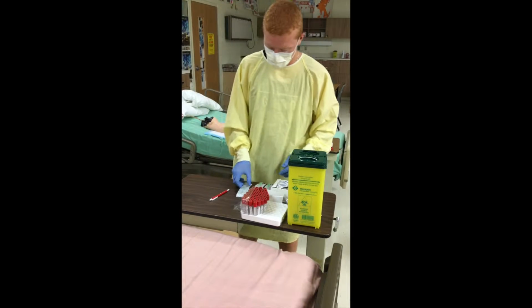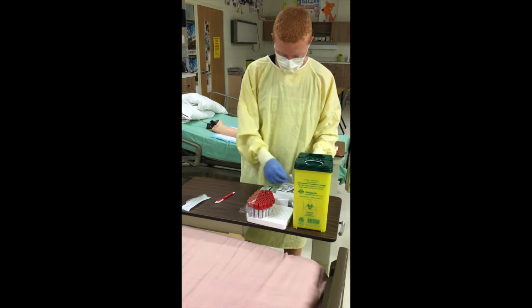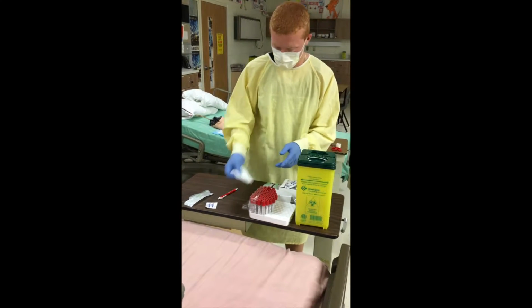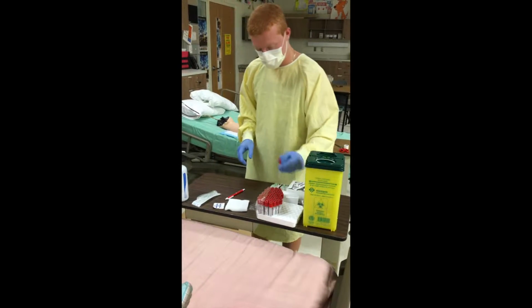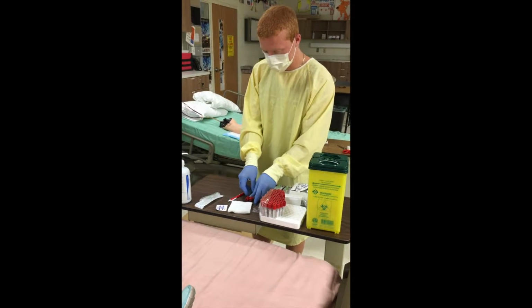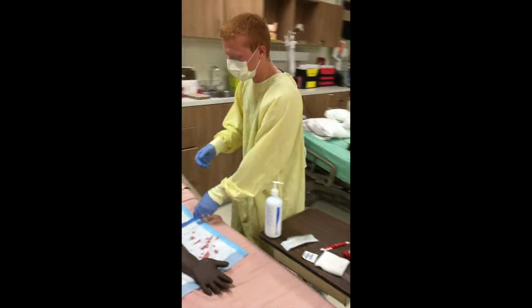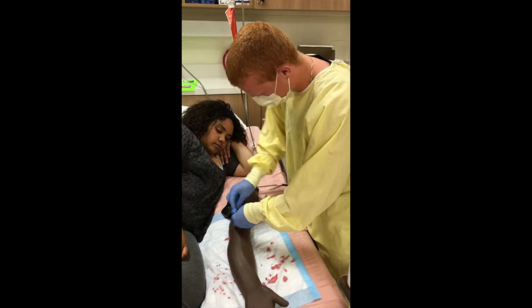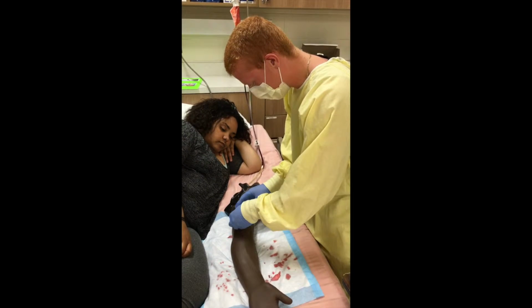Okay, so to take blood, we're going to have Vacutainer, alcohol wipe, some gauze, and we're going to collect it in these vials. So first, go over to the arm and wrap the tourniquet around it, not too tight. Just enough.